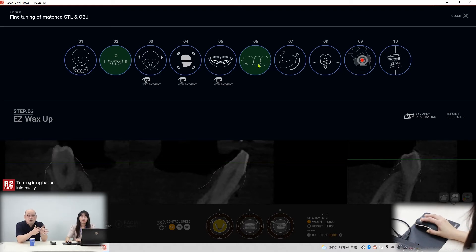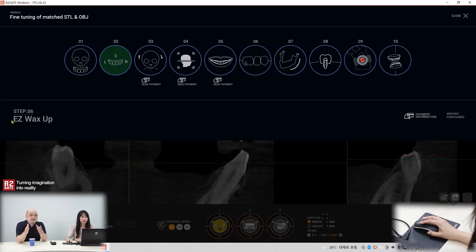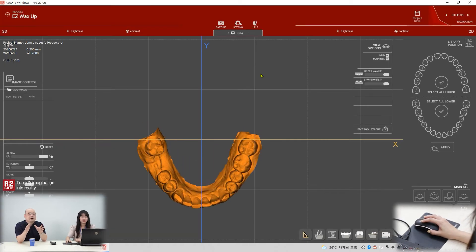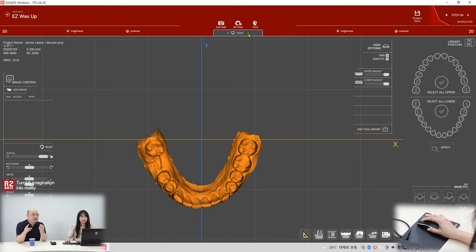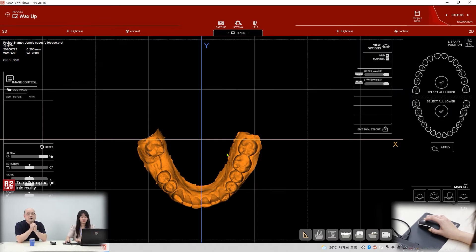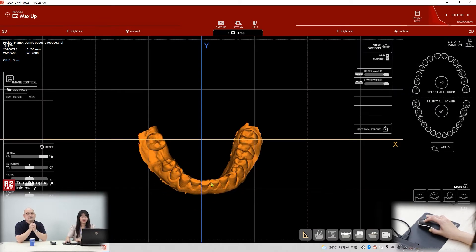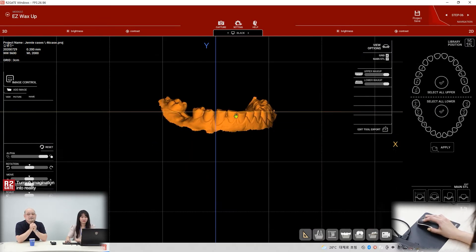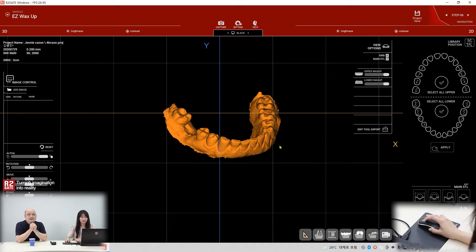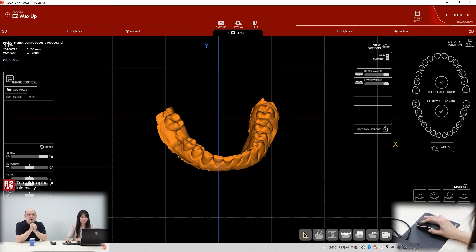So steps 1, 2, and you have to do step 6. What's step 6? The easy wax up part. That means you can make some wax ups here. Yeah, that's the STL file.